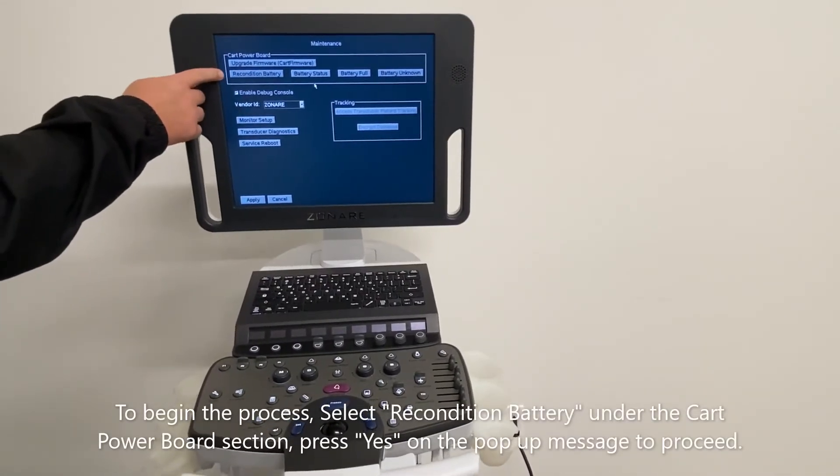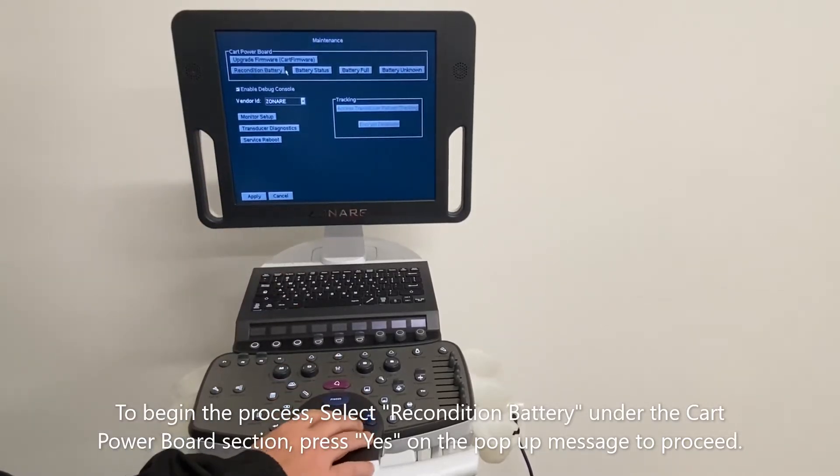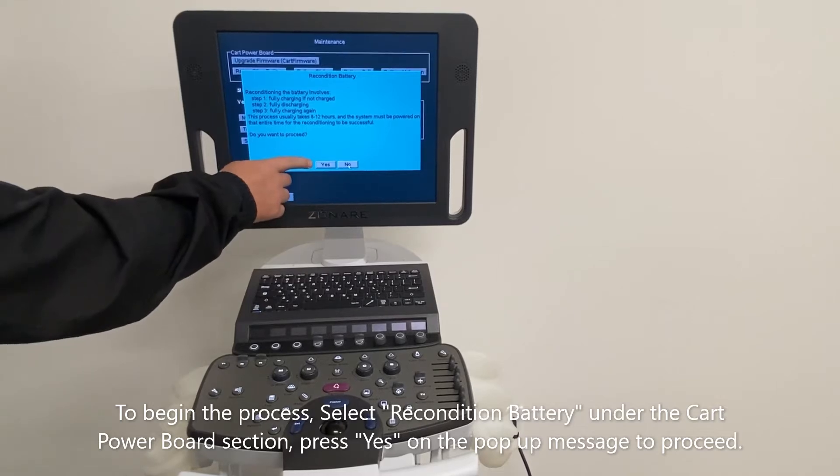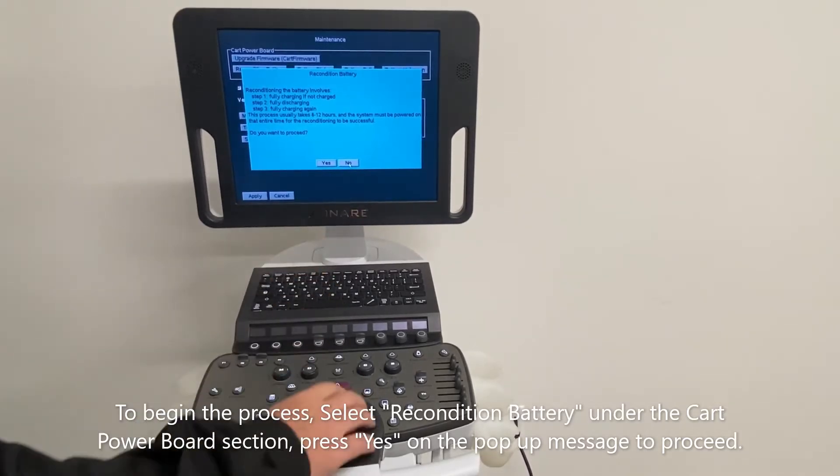To begin the process, select recondition battery under the cart power board section. Press yes on the pop-up message to proceed.